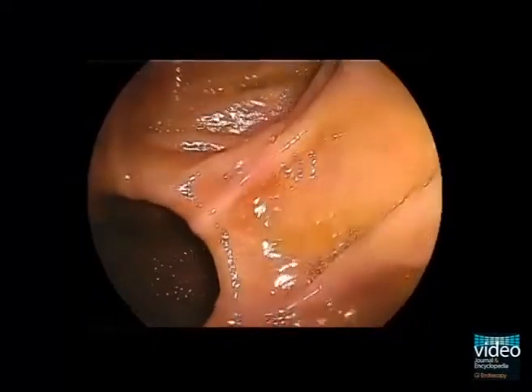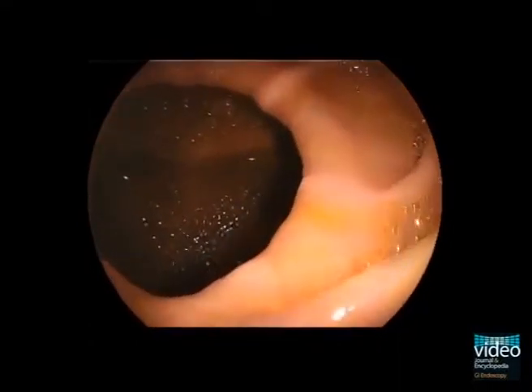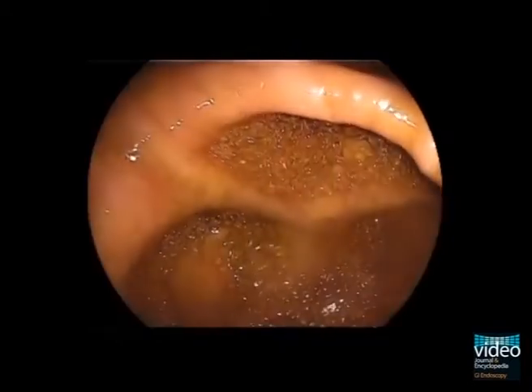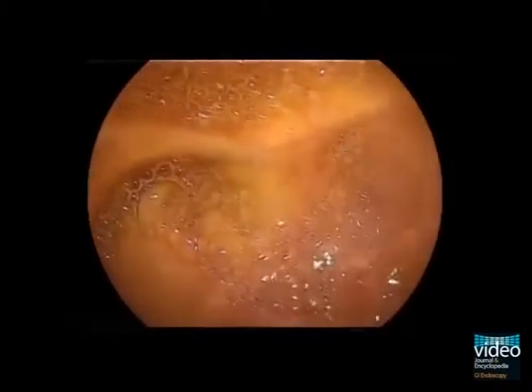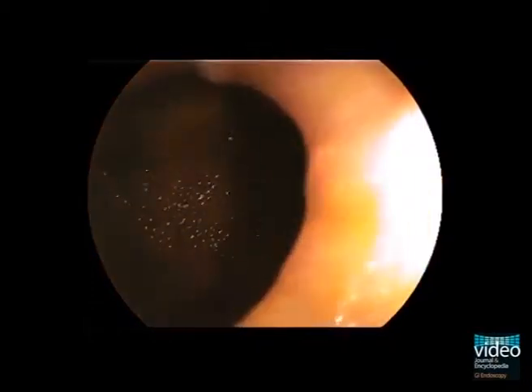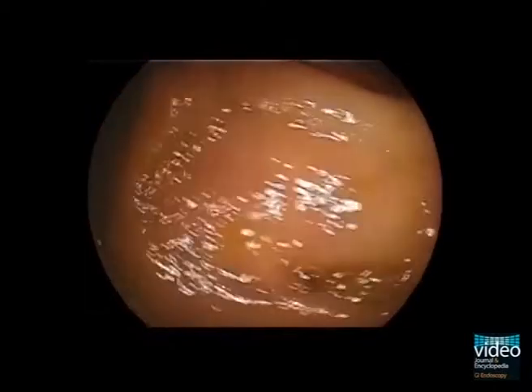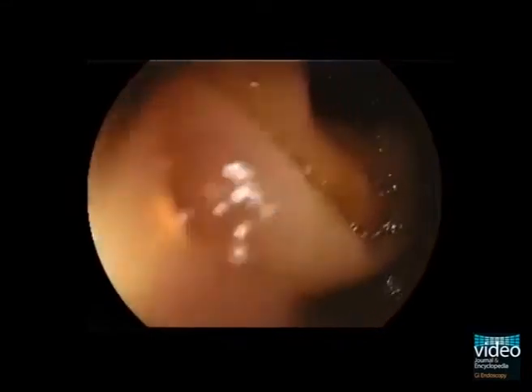Approximately 1 meter distal from the pylorus, the ostium of a large diverticulum was observed. There were no signs of inflammation or recent bleeding. There were no other diverticula observed, nor were there any abnormalities in the jejunum.